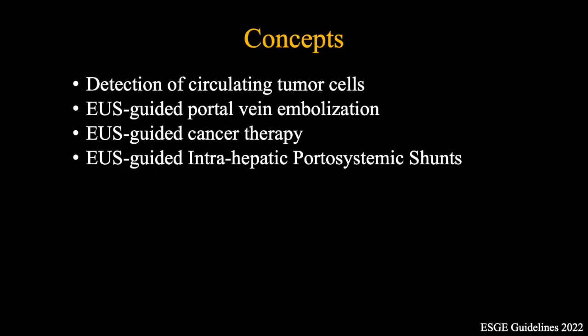As circulating tumor cells have been found more frequently and in higher numbers in the portal vein than in the peripheral circulation, also in sufficient quantity for proteomic and genomic profiling in pancreatic biliary cancer, portal vein blood sampling holds great promise in the near future.